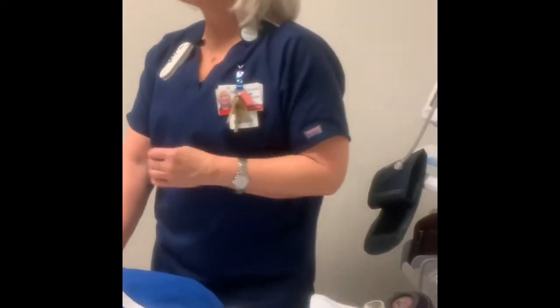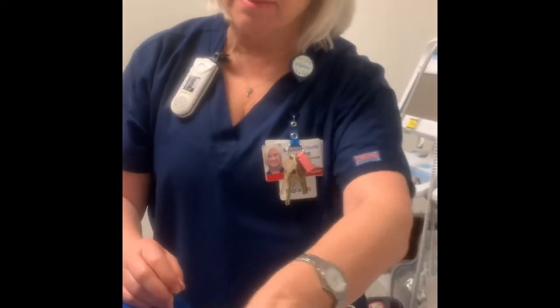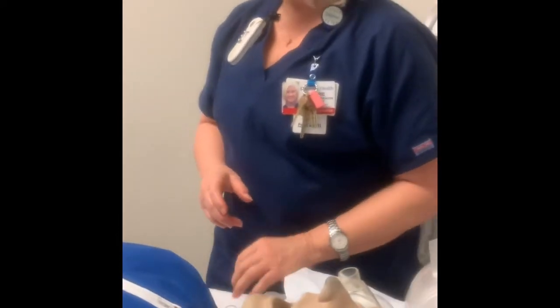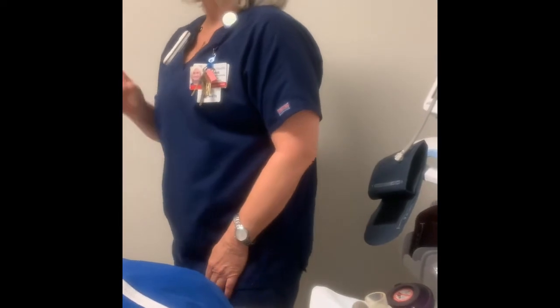So let's start with our first altered airway. So we have a tracheostomy tube in, but you have a patient here and this maybe pops off right here. Now your trach tube comes out. What are you gonna do? Your tracheostomy tube comes out. What are you gonna do?